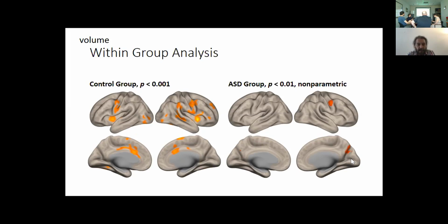But I think the reality is, if I'm understanding it correctly, the amount of motion is going to affect whether we can see, if there's a lot of motion, the contrasts are going to come off in slightly different areas. If you want to correct for that, you can still add a motion covariate within single groups, only you enter the motion covariate centered at the group specific average.